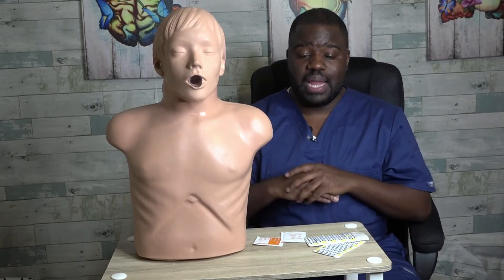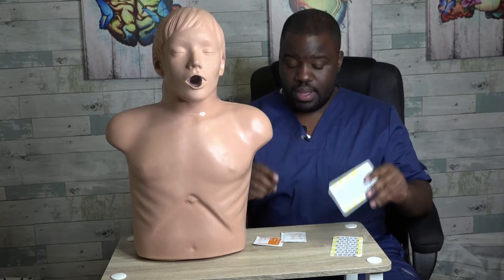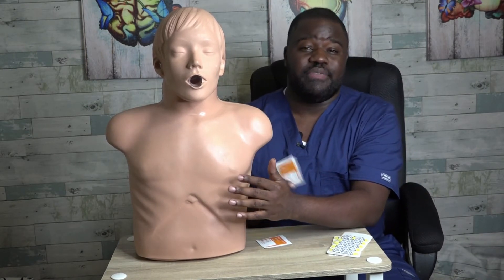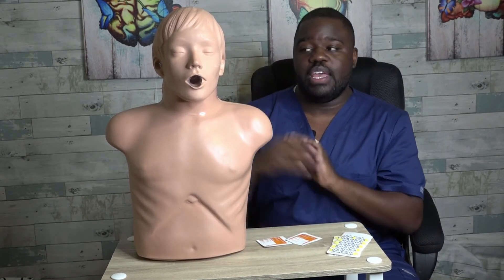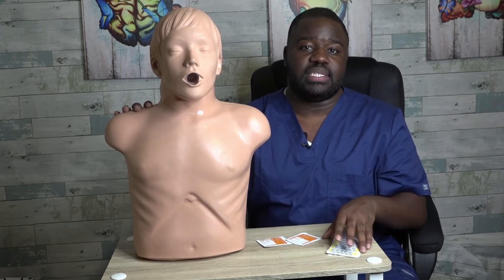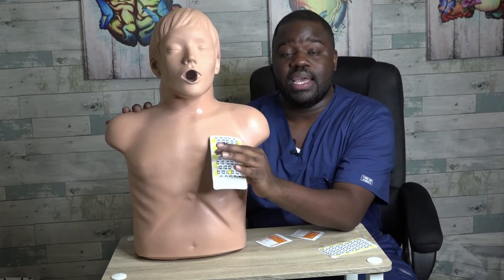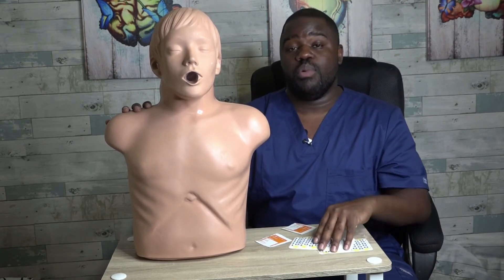First, gather your supplies. I have gathered electrode stickers — these are the stickers that will stick on the patient's skin. I've also gathered alcohol prep pads to cleanse the top layer of skin of any dirt, excess oil, creams, or lotions. Note that if a patient has hair on their chest, you should cut or trim that hair so the electrode stickers adhere properly to the skin and not to the hair, which would cause artifacts on the EKG lead and make it read incorrectly.